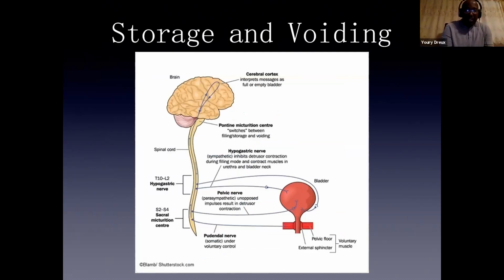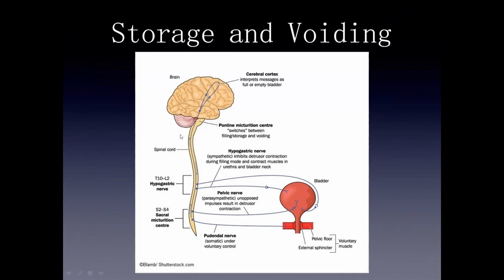Excuse me, what is the definition of EMG? Oh, the electromyogram, so the neurologic signal from the external urinary sphincter. Okay. As I told you earlier, it's a little bit new for us. Oh yeah, no worries. I ask you a lot of questions. Oh no, I appreciate that because obviously in medicine we all use a lot of shorthand that is not standard across everybody.